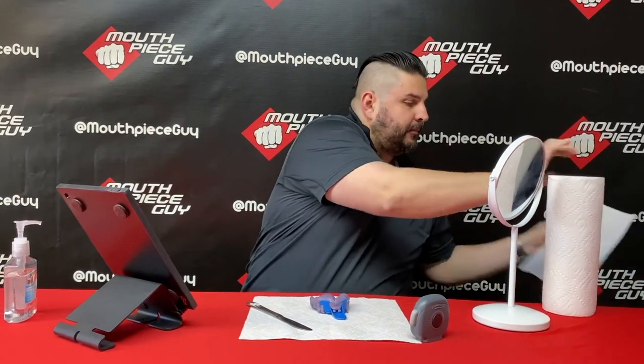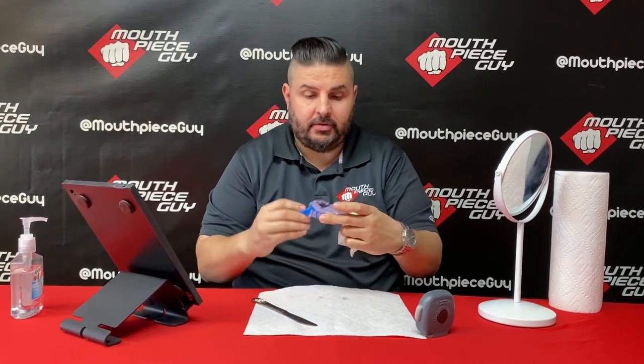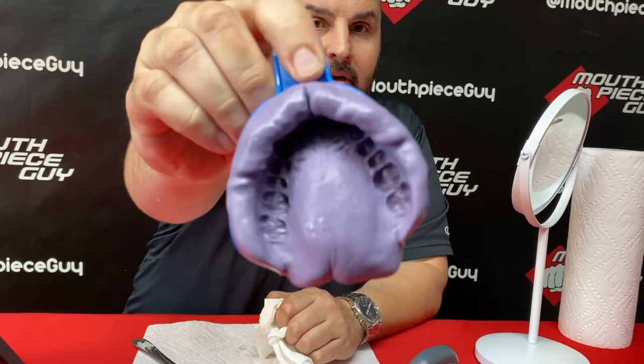That's always disgusting. But there you have it — that is what a good impression looks like. You can see we got all the teeth, all the gums, everything centered.